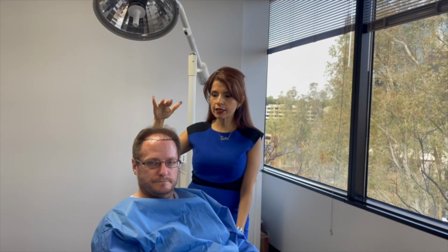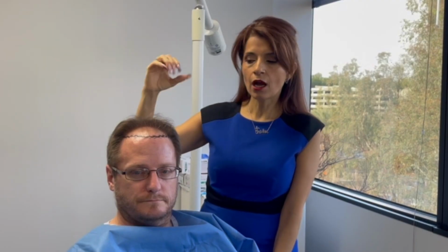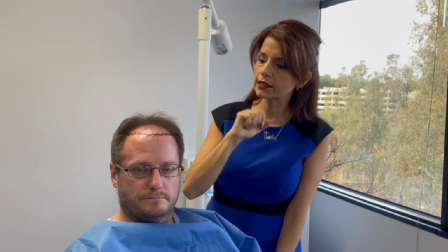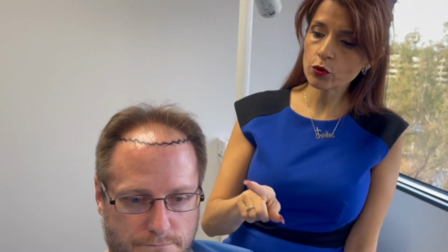We just finished drawing his hairline. As you can see, it's very jagged because hairlines are not a perfect semicircle and they are not perfectly straight either. And then you can see little scragglers that we placed there just to break it up, his little rogue hairs. His nose measures about 6.5 centimeters, and we did locate his hairline about 1 centimeter above where his hairline used to be because his face is evenly broken into thirds.